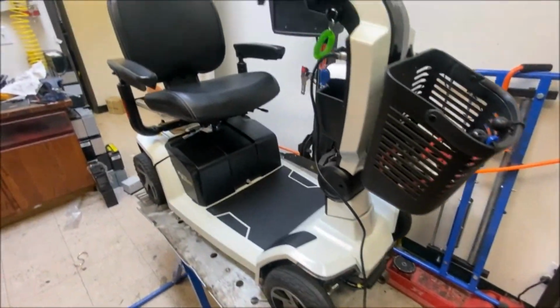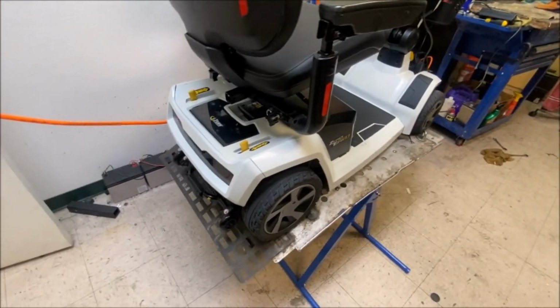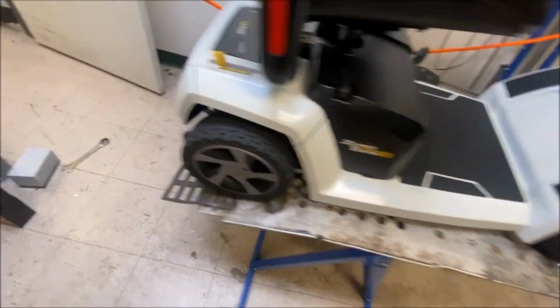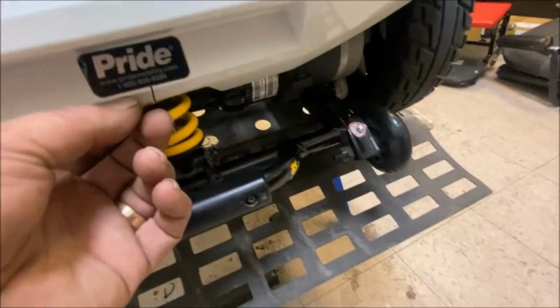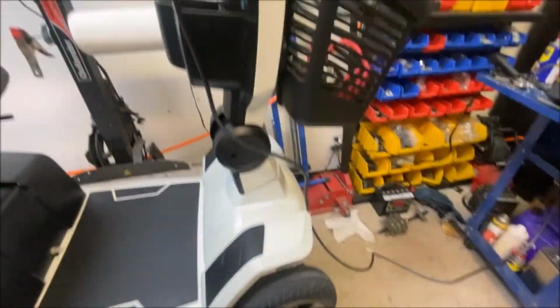Alright, all serviced, all done. Another one ready to go back on the road for their owner. And back to Montana. Yep, all done, couldn't find any faults. A couple of loose screws. I think there's a broken shroud down this corner there. It's a little break, all superficial stuff. But yeah, all the lights work, everything works.